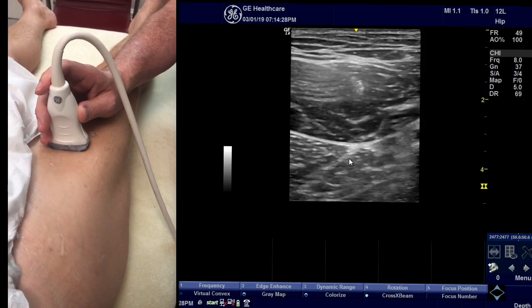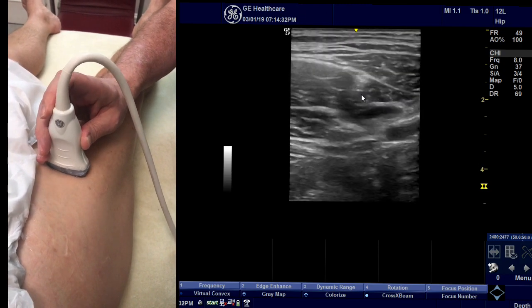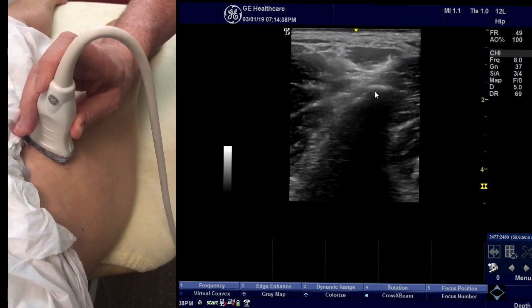You start by scanning in short axis the rectus femoris, then follow it up along the direct head right up until you get to the inferior spine.